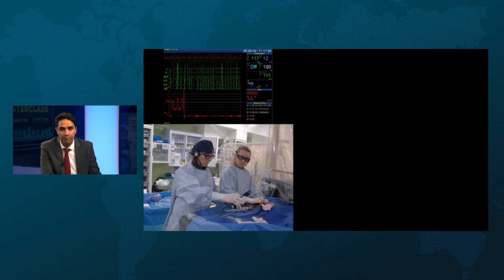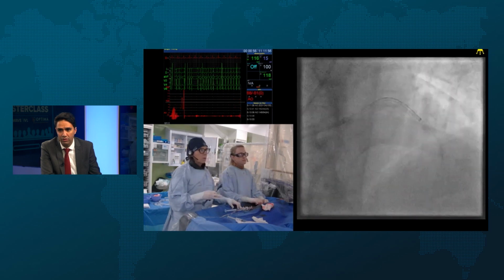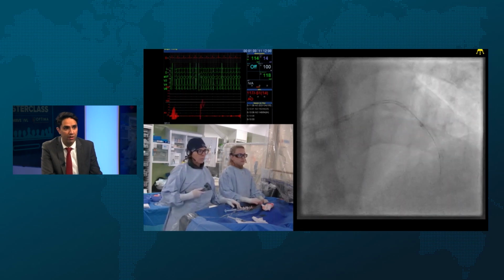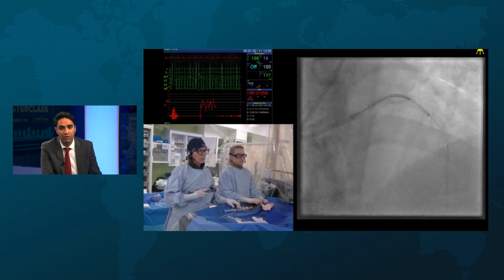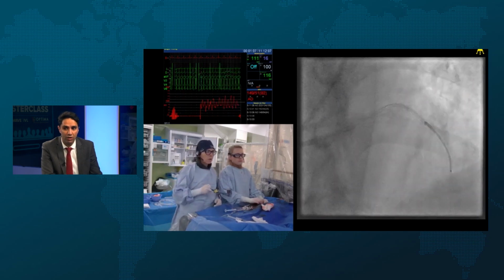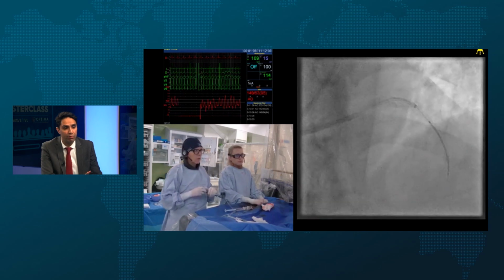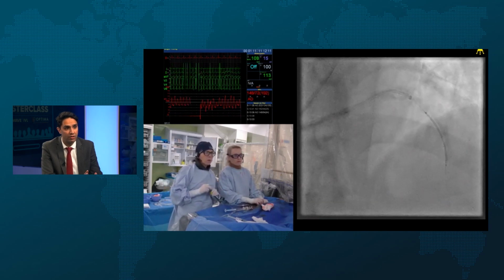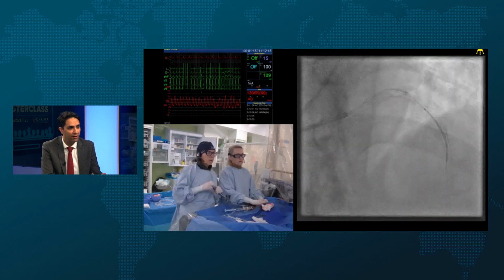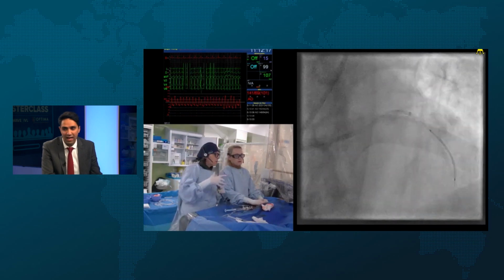We actually published the 2-year data in JACC Interventions. I think it should be out either this week or next. Eruptive calcified nodules have a 20% event rate at 2 years, and non-eruptive calcified nodules have about 5%. The mechanism of failure is the reprotrusion of these eruptions through the stent struts. They're thrombogenic, they're flow limiting, and they happen at these sites of torsional stress.